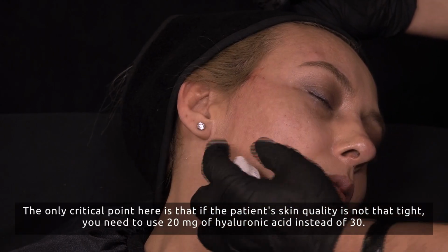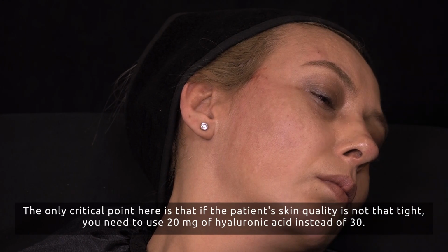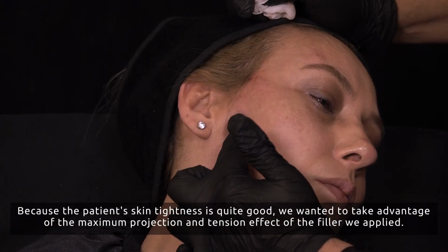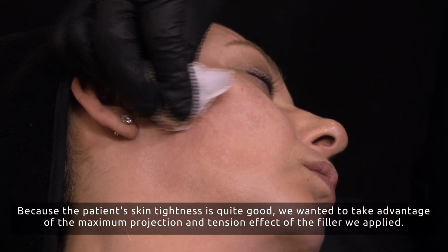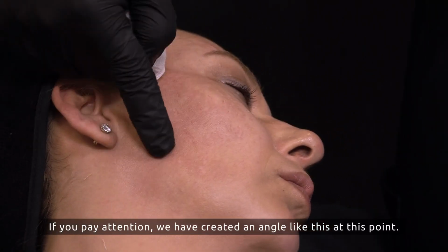The only critical point here is that if the patient's skin quality is not that tight, you need to use 20 milligrams of hyaluronic acid instead of 30. We are using the 30 milligram form of Gloderm here. Because the patient's skin tightness is quite good, we wanted to take advantage of the maximum projection and tension effect of the filler we applied. If you pay attention, we have created an angle like this at this point.